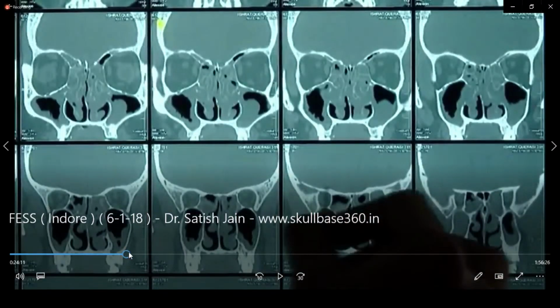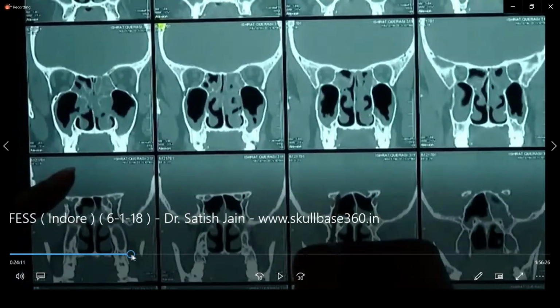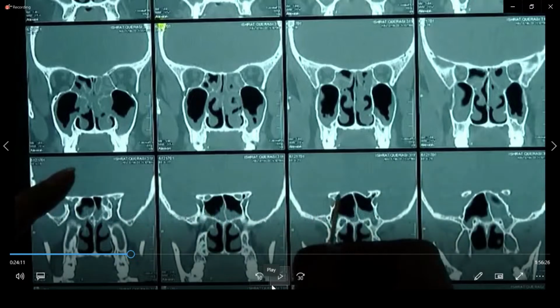And in this particular patient, you see the pansinusitis disease involving almost all paranasal sinuses, more on the left side, this lateral recess of the sphenoid, on the right side as well, with some opacification. So this is a sort of pansinusitis, which I'm going to take you to the surgical step. Surgical steps of sinus surgery are important to understand to prevent complications.